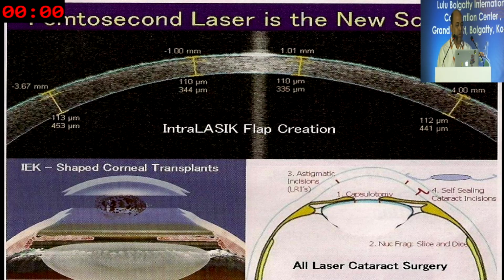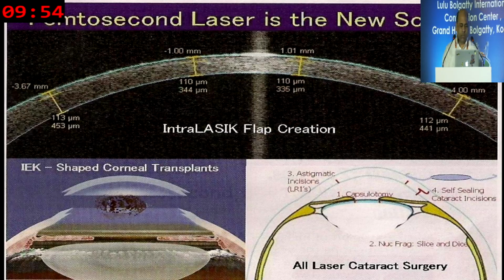It won't be wrong to call the femtosecond laser the new scalpel in the ophthalmologist's hand. With this new device, we can do cataract, LASIK, keratoplasties, and whatnot. Everywhere you will find some role of the femtosecond laser nowadays.